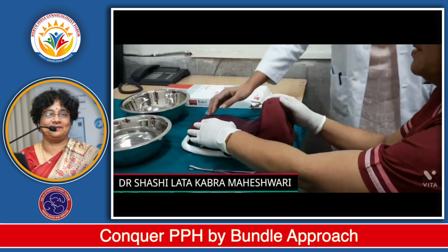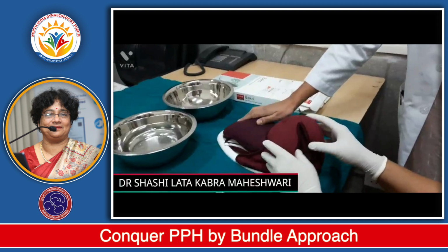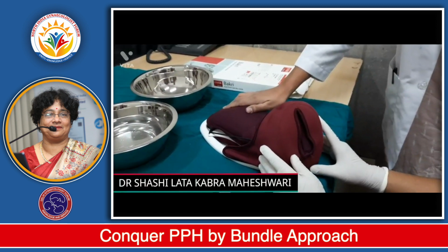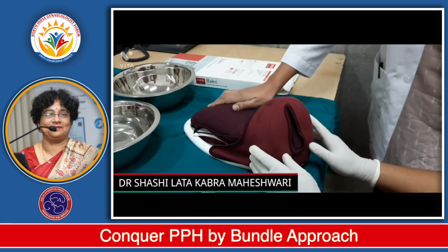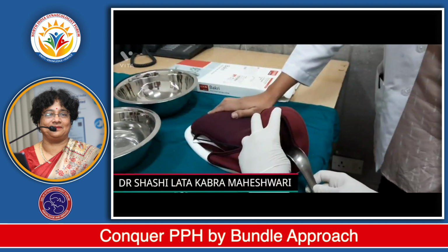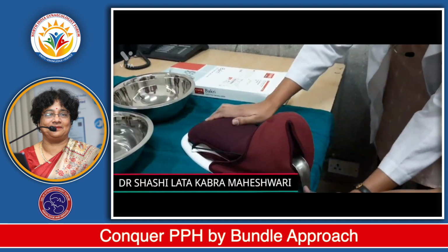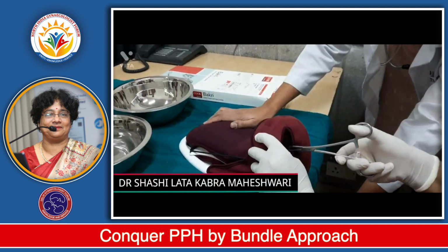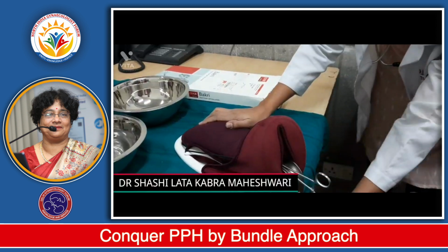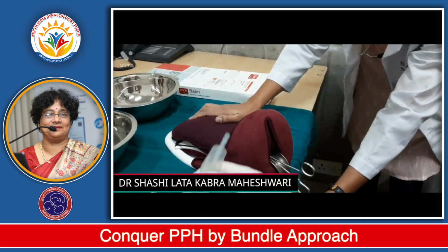So first thing is this, that this is the perineum. We have to clean the perineum. We have to do the antiseptic dressing and proper draping. And the next is that we have to put the speculum like this to retract the perineum, and then we have to get hold of the cervix. And next is the insertion of this Bakri balloon.